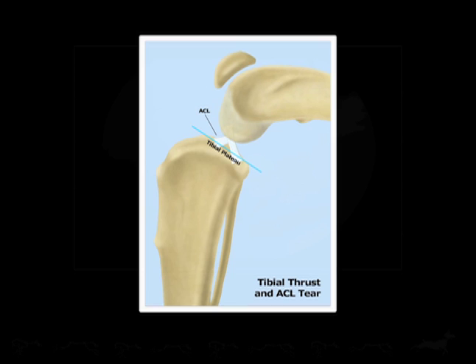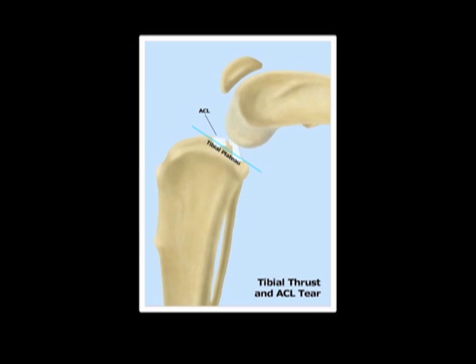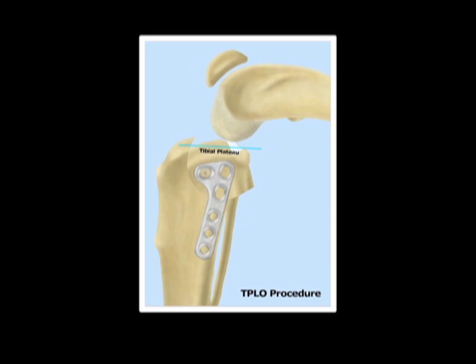But before we do that, I'd like to give you an overview of the procedure. This is the illustration that we've seen numerous times throughout this presentation. During weight bearing, we see the femur slide down and back, tearing the ACL. The surgical procedure involves making a curved bone cut in the tibia and rotating the top section until the tibial plateau's level, then securing that section with a bone plate. The bone heals wonderfully, like it was never cut. The bone plate becomes obsolete after months, but we usually don't feel it's necessary to remove it. So that's an overview.